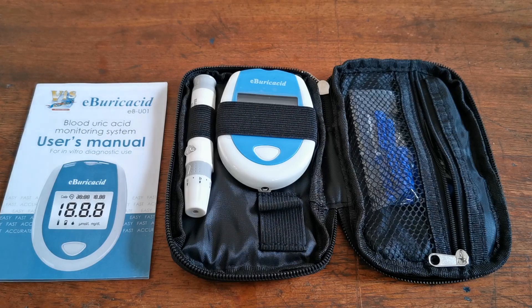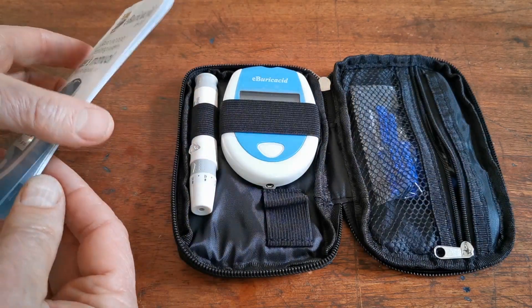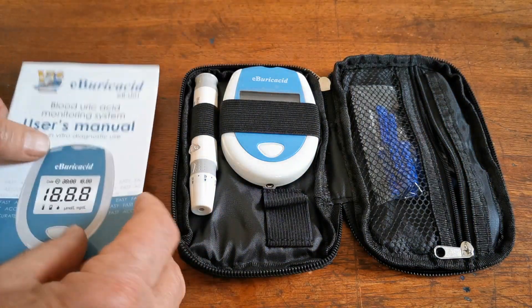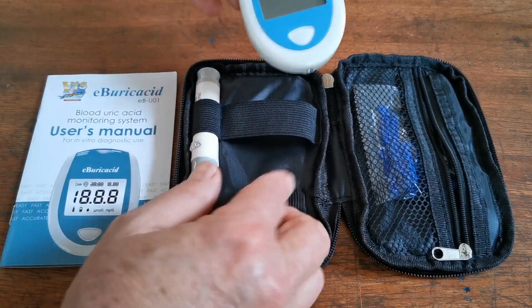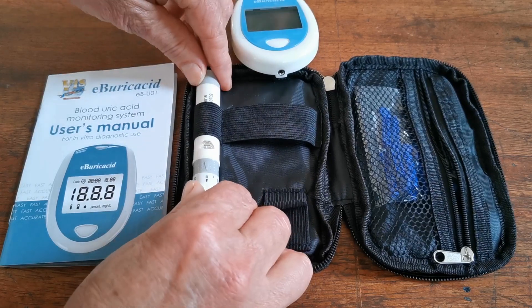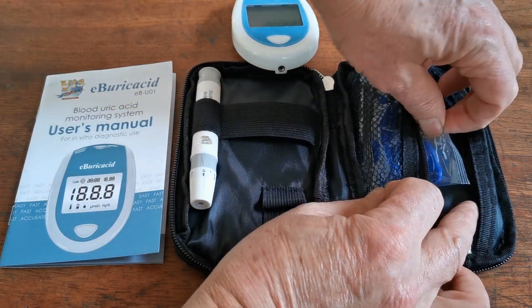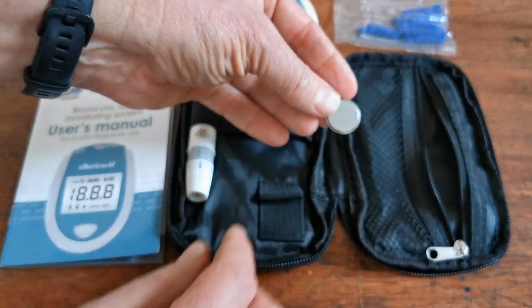Inside the box you get an EB-Uric Acid User's Manual, which is very clearly written, nice and easy to follow, with lots of useful information about how to set up the meter and operate it. You get the EB-Uric Acid meter itself, a spring-loaded auto lancing device, some lancets in the side pouch, and the CR2032 battery.